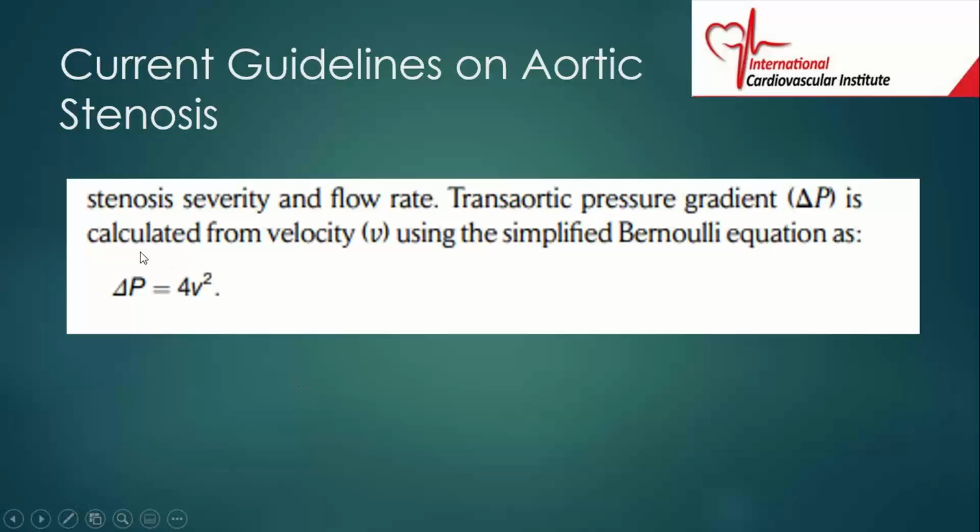And if you remember your simplified Bernoulli equation, gradient is equal to 4v squared, where v is the velocity.